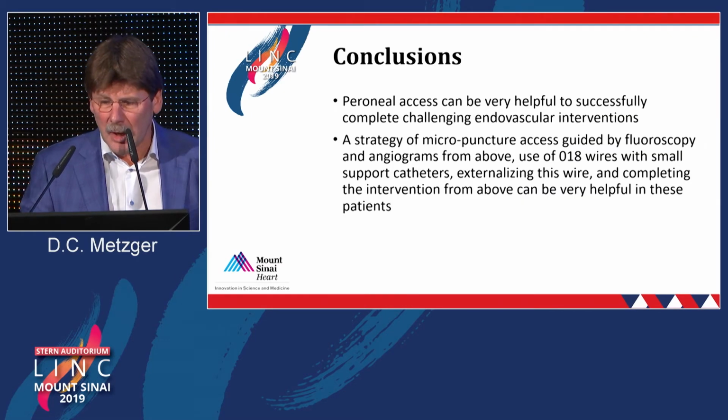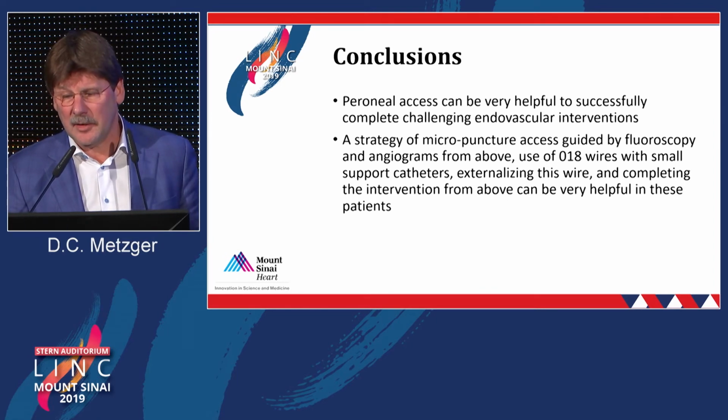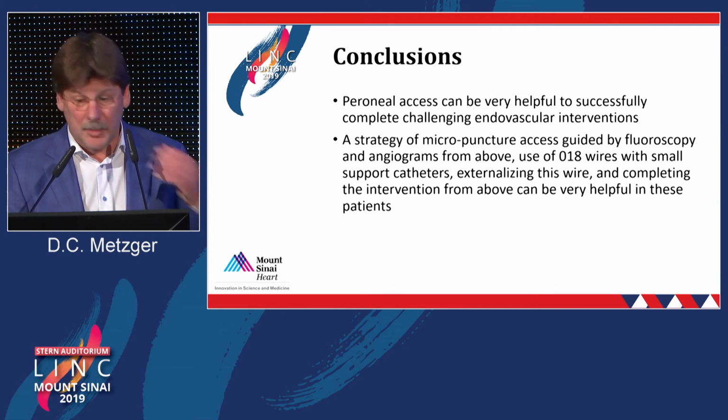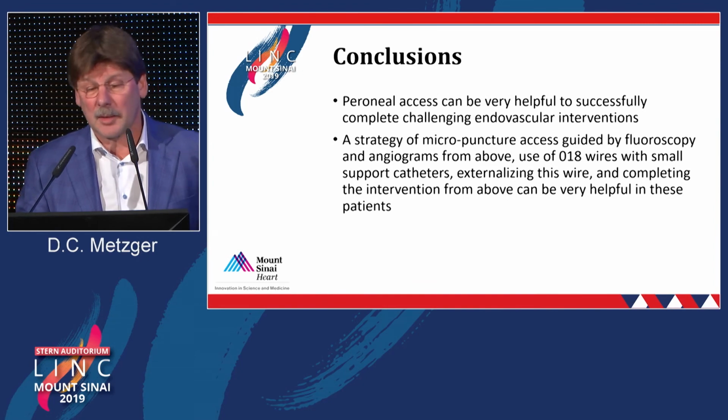So, in conclusion, peroneal access can be very helpful to successfully complete challenging endovascular interventions. A strategy of micropuncture access guided by fluoroscopy and angiograms from above and use of low-profile equipment from below can be very helpful for these folks.